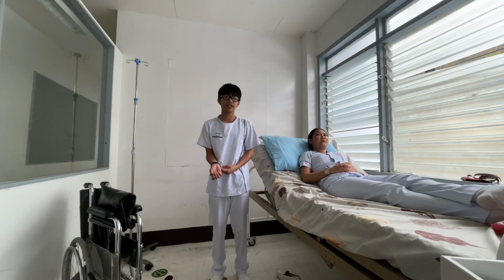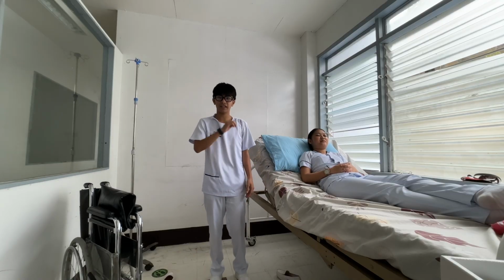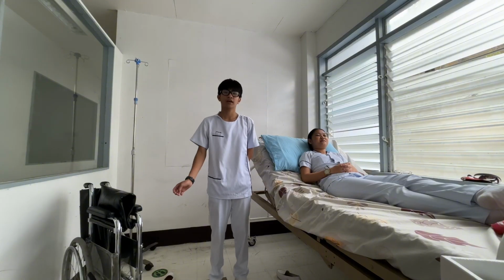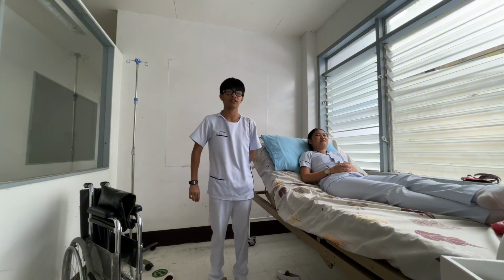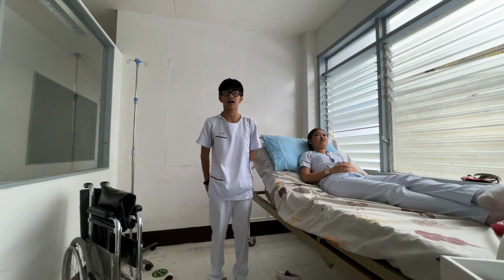Next is place the bed to the lowest position and raise the top. So as you can see, I have raised the head of the bed as high as the patient can tolerate. Then ensure that the bed brakes and wheelchair brakes are applied.